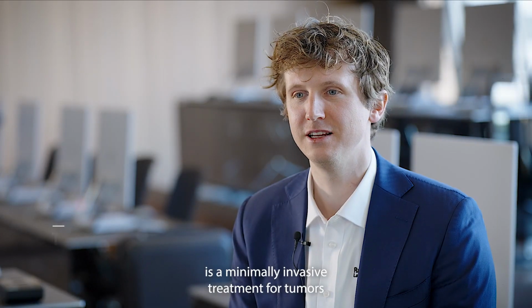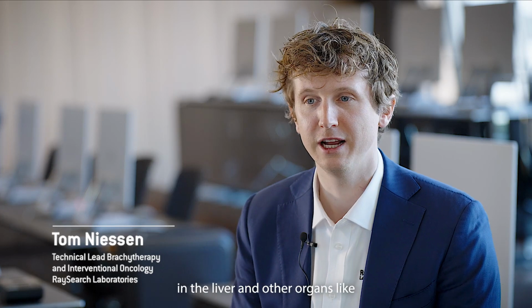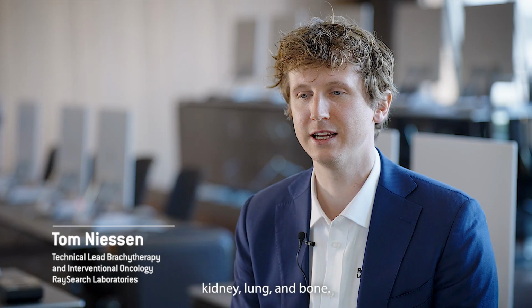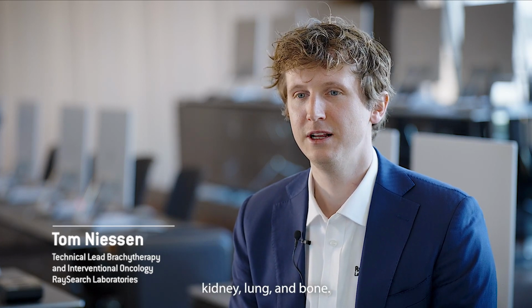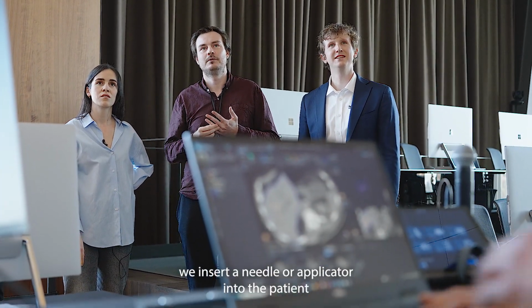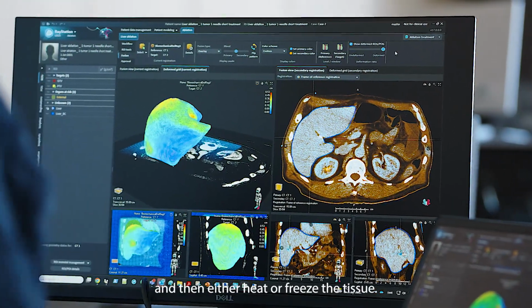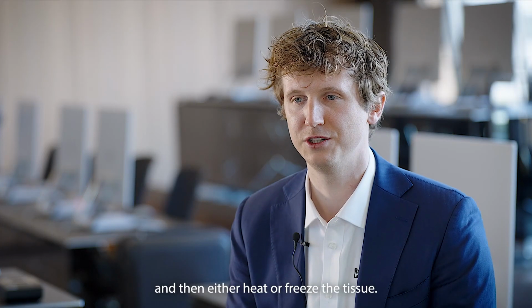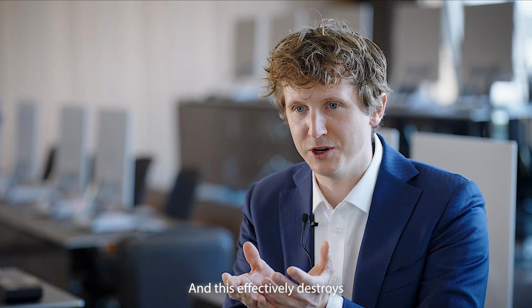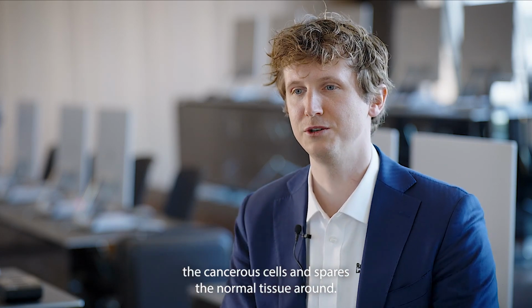Thermal ablation is a minimally invasive treatment for tumors in the liver and other organs like kidney, lung, bone. In this type of treatment, we insert a needle or applicator into the patient from the outside, interstitially, and then either heat or freeze the tissue. And this effectively destroys the cancerous cells and spares the normal tissue around.